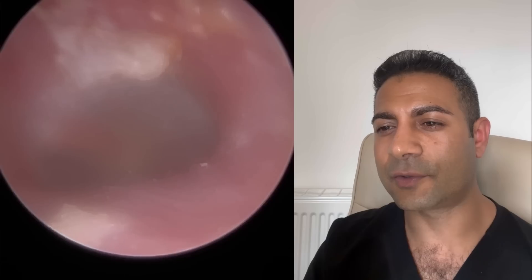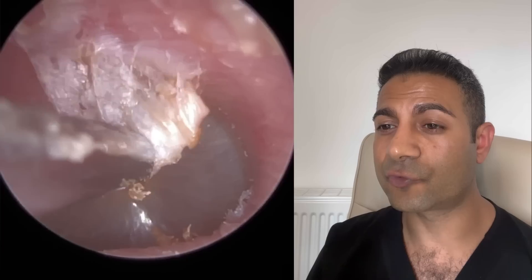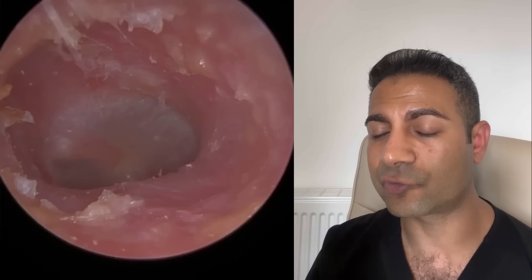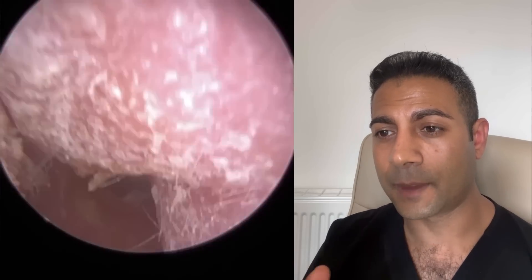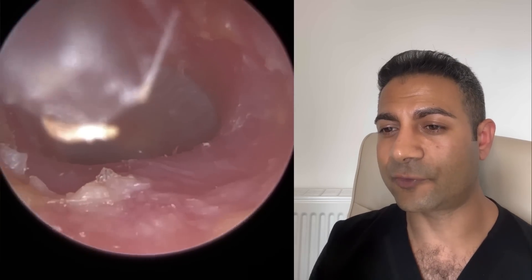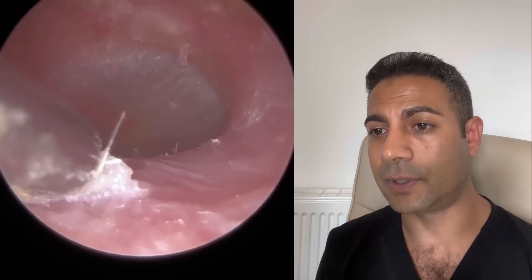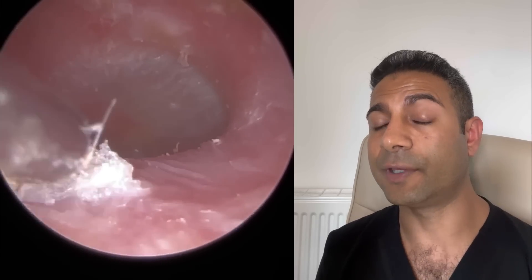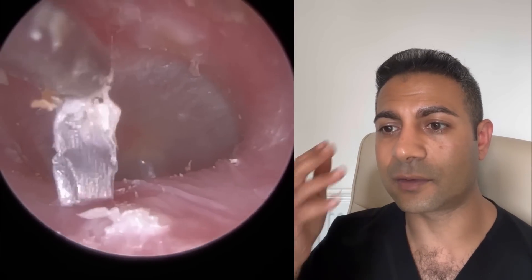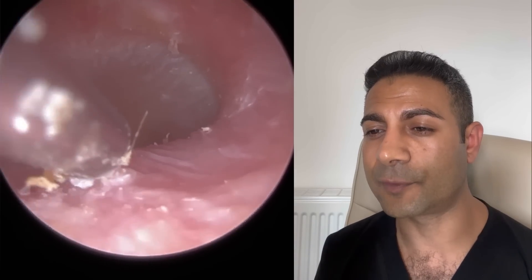As I'm going into the ear, the lens got a bit foggy and misty. That's just because this patient's ear canal temperature is somewhat raised because of the inflammation, infection, and humidity. Because the lens of the endoscope is the coldest part when we enter it in the ear, condensation settles on the tip. It will naturally clear itself — if I just remained in the ear with the endoscope for about 20 or 30 seconds, it will de-mist itself. But as soon as you enter with the suction probe and vacuum the ear, that reduces the ear temperature and eradicates the condensation at the tip of the endoscope.